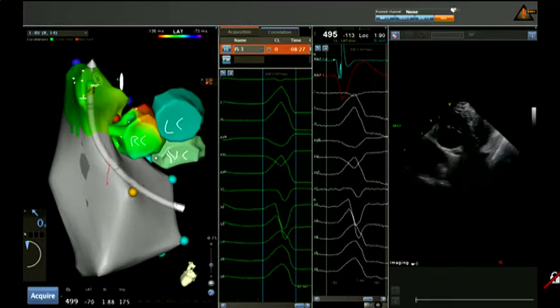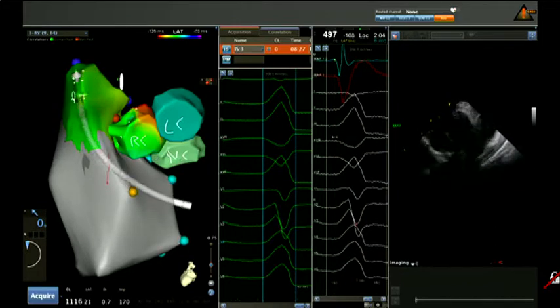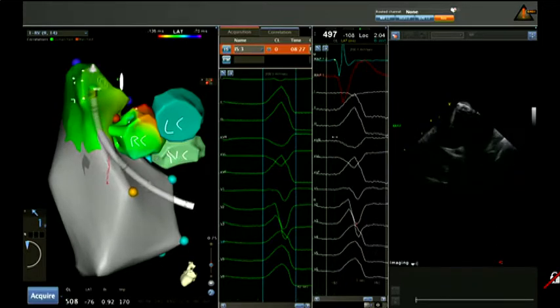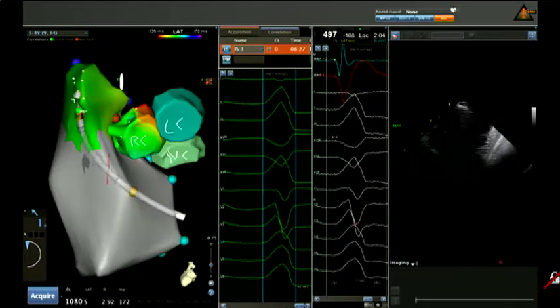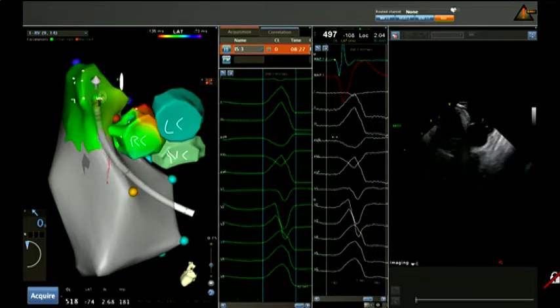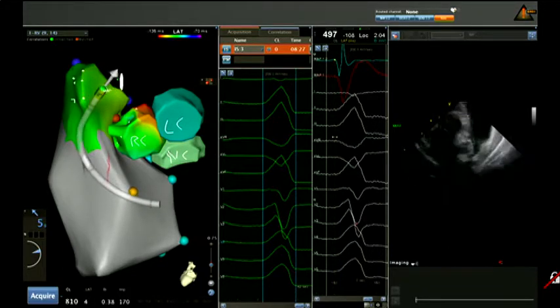In ICE, because there are some places in Latin America that don't have access to ICE technology. So can you show us the X-ray imaging and give us some clues about the X-ray orientation, please?